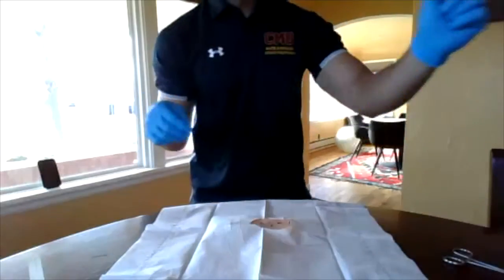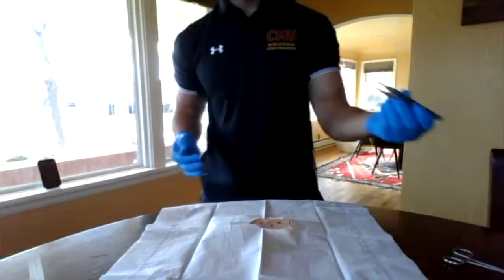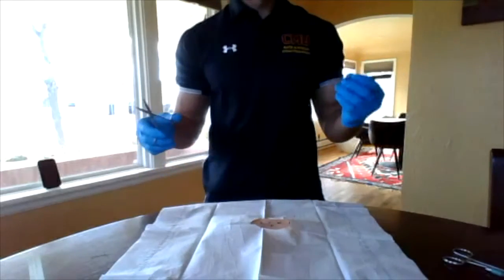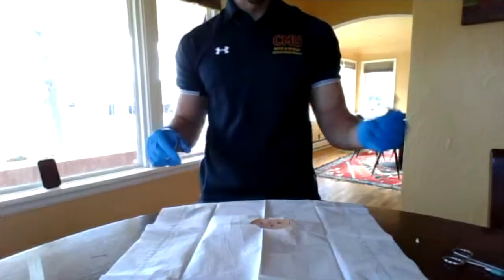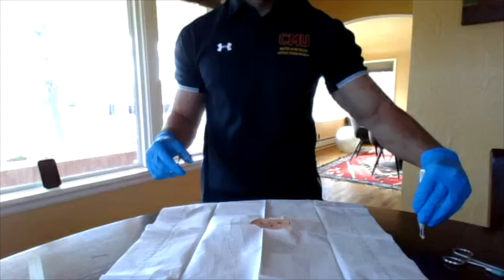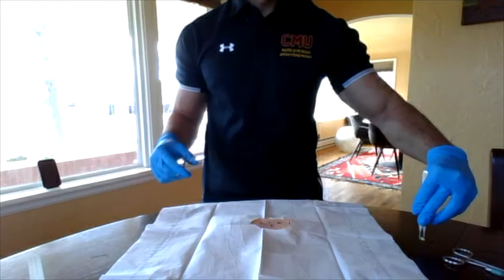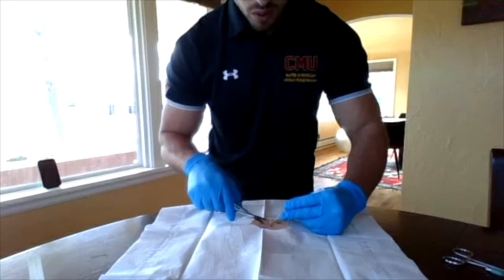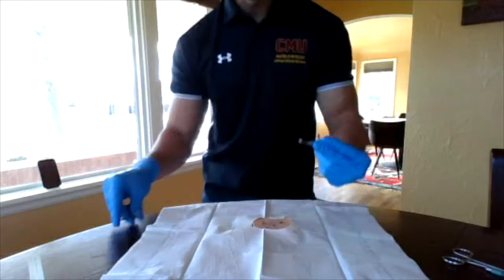The next step is you're going to grab your tweezers and your scissors, and you're going to be careful when you're removing the biopsy, and be sure not to compress it. As you're removing the biopsy, you also want to be snipping away the subcutaneous tissue. So we're pulling it out and we're snipping away the subcutaneous tissue.